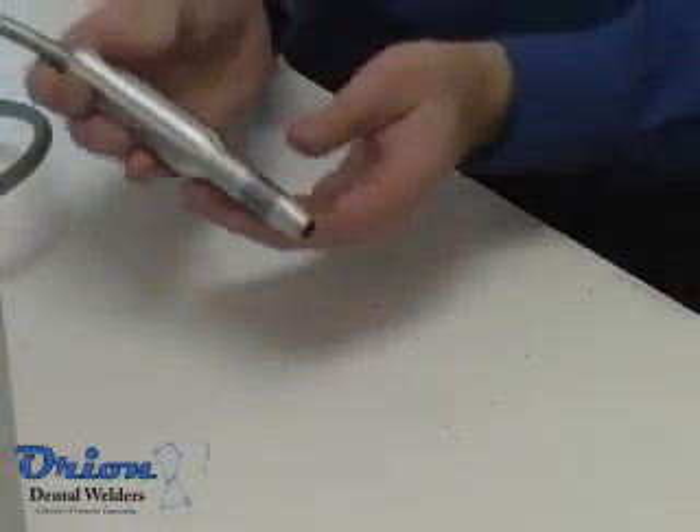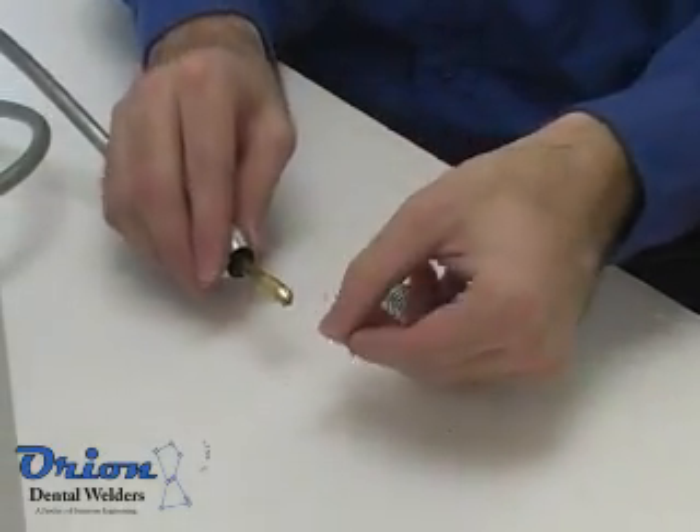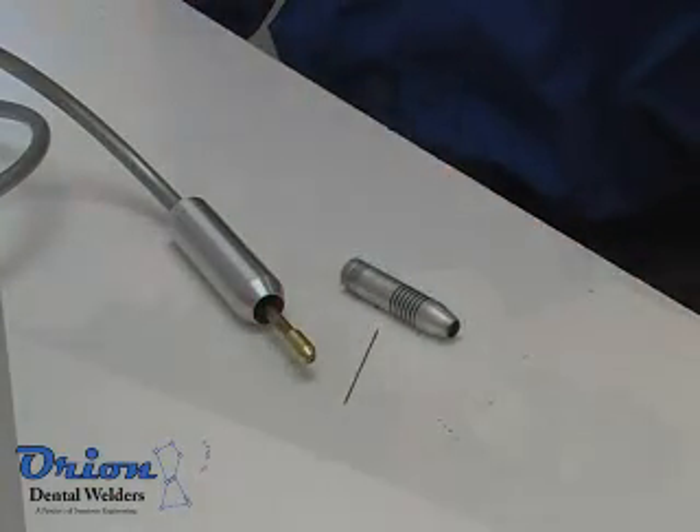To remove the welding electrode, gently pull on the gas flow stylus cone and then unscrew the electrode collet. For different sized electrodes, you will need different collets.